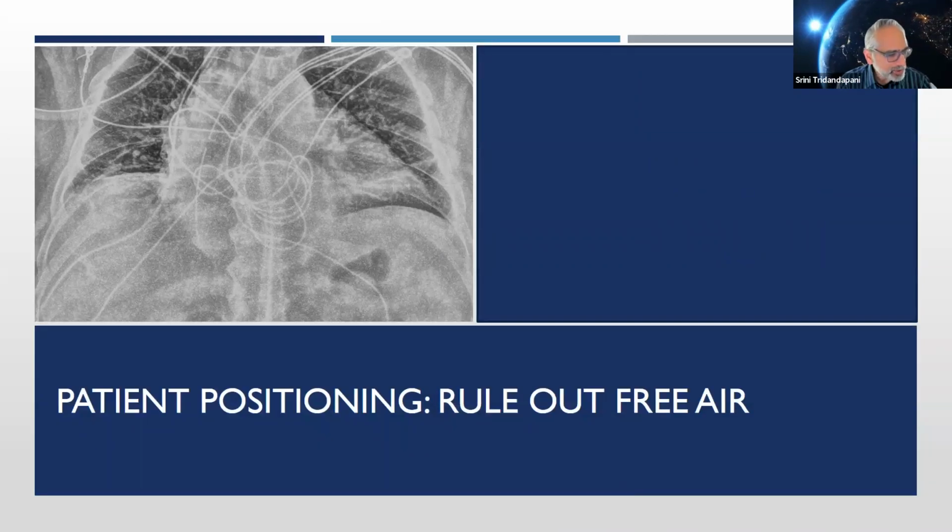So here was a study, a radiograph of the abdomen, which was obtained to rule out free air. Free air is what you get if you have a bowel perforation. So you have a gas within your bowel, and if that bowel is perforated, the air leaks out into your abdominal cavity. And what it does is, if you're sitting upright, that air will sit under the diaphragm, just below the lungs, under the diaphragm. It will pool there.